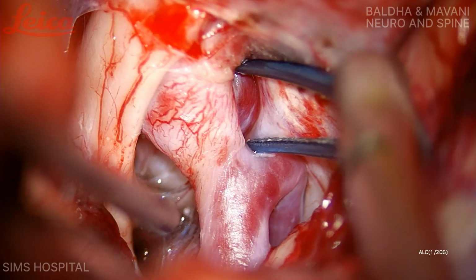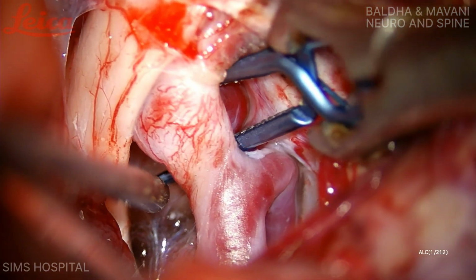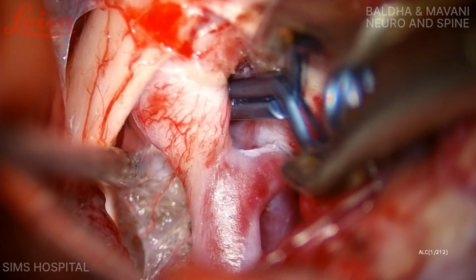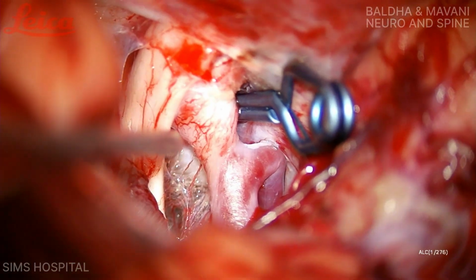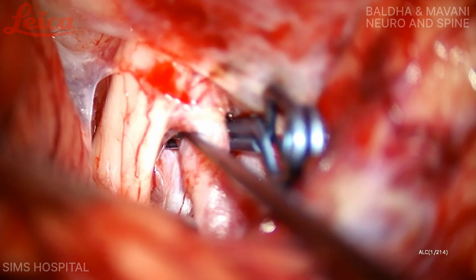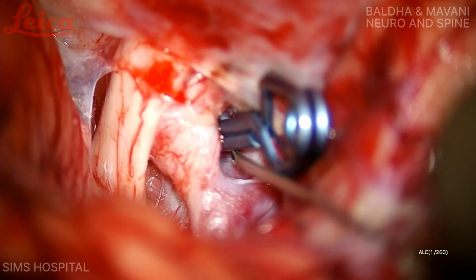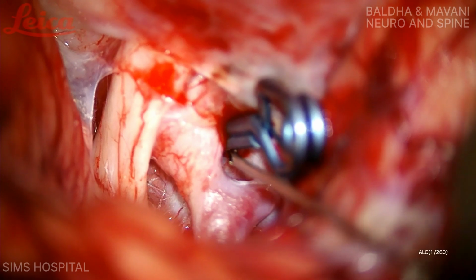A curved clip is applied at the neck of the aneurysm. Note that proximal control is taken in the neck in this patient. See the tip of the clip visible medial to the ICA, confirming total inclusion of the neck of the aneurysm. The dome of the aneurysm is punctured with a needle to decompress and confirm total occlusion.